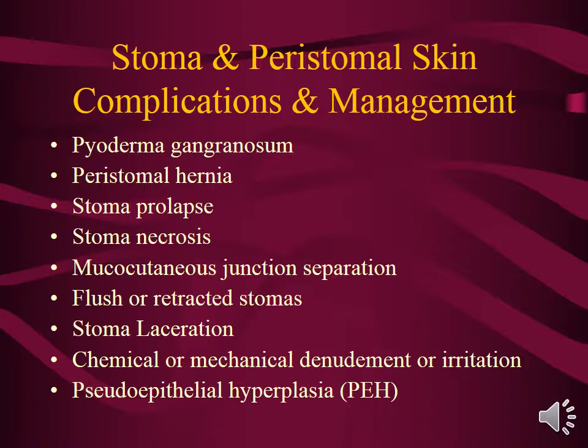Flush or retracted stomas is something that's extremely common for an ostomy nurse to have to deal with, and we'll talk a little bit about products as far as what we do with that, because sometimes you don't get that perfect ideal stoma, and so that's where an ostomy nurse comes in. Stoma laceration can occur pretty easily because there are no nerve endings and the patients don't feel it, so it's just like having a cut in your mouth.